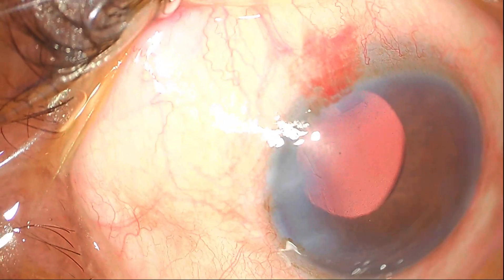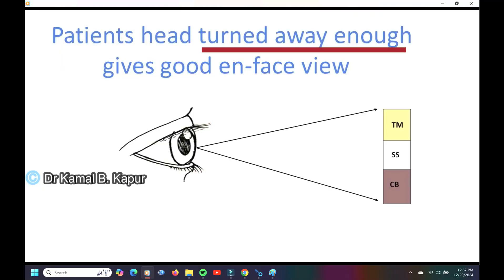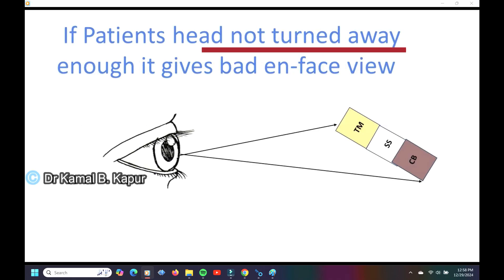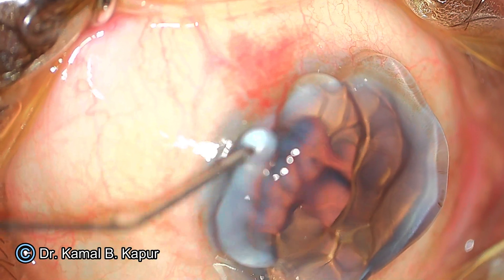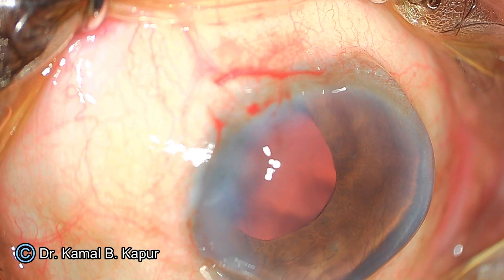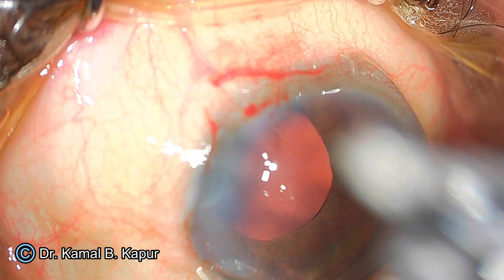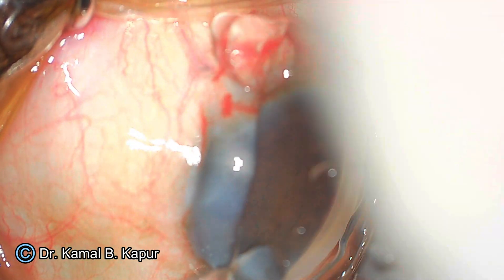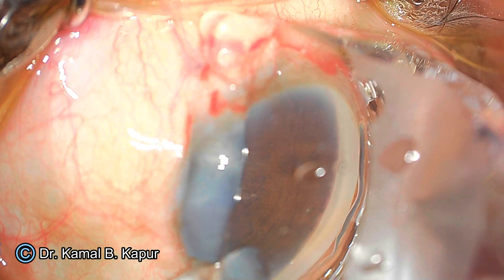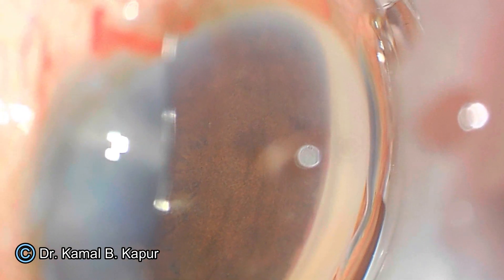Tilt the patient's head away from you by approximately 35 to 45 degrees. Shifting the patient's head gives a very good view of the trabecular meshwork; without doing so, you will have a bad en-face view. Apply more viscoelastic onto the cornea, ensuring no blood or air bubbles, then place the gonioprism lens on the cornea. Zoom in to confirm a very clear view of the TM.